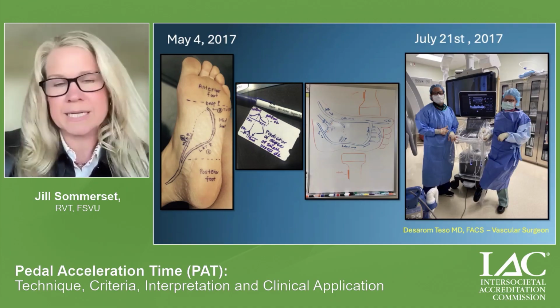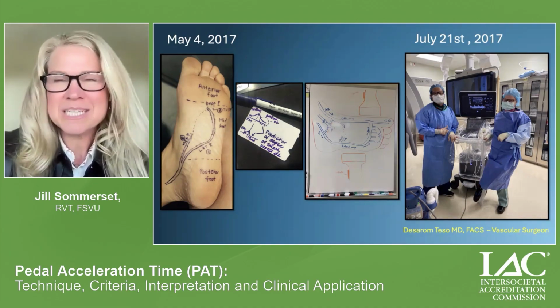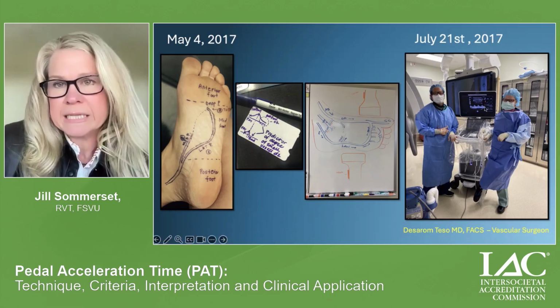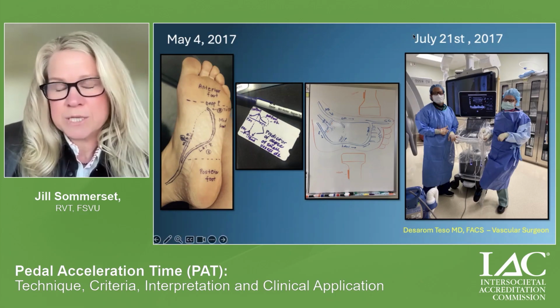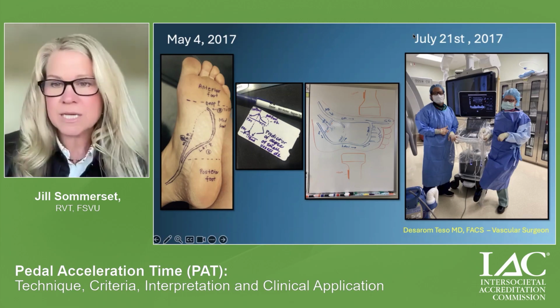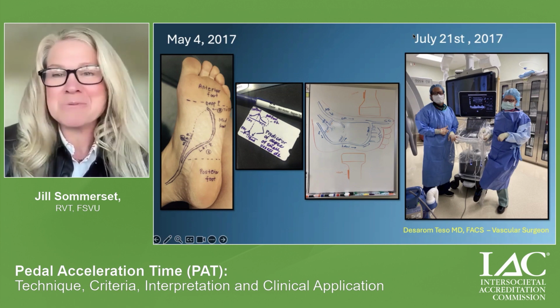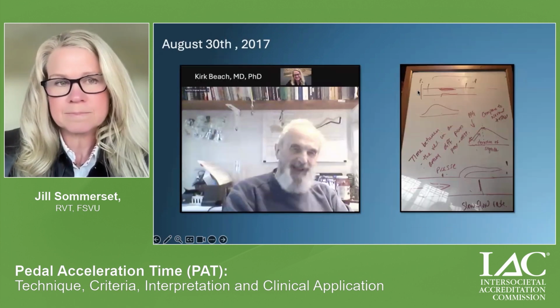So we would whiteboard in a small community hospital in the hallway, and really put our mind to understanding pedal perfusion. And this was really a landmark photograph on July 21st, 2017, when he said, let's come into the cath lab, let me open the vessels and see if we can see the change using pedal acceleration time. And we did. And that was really an extraordinary moment.